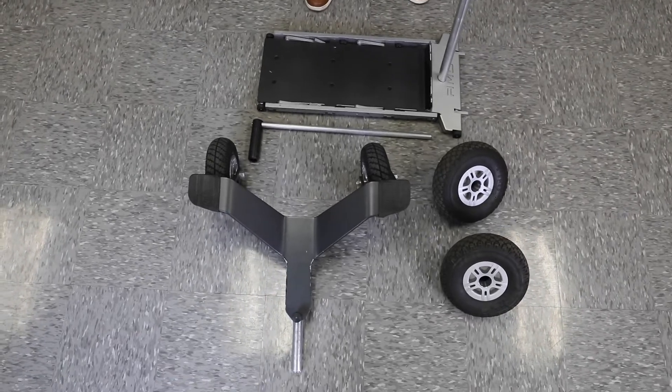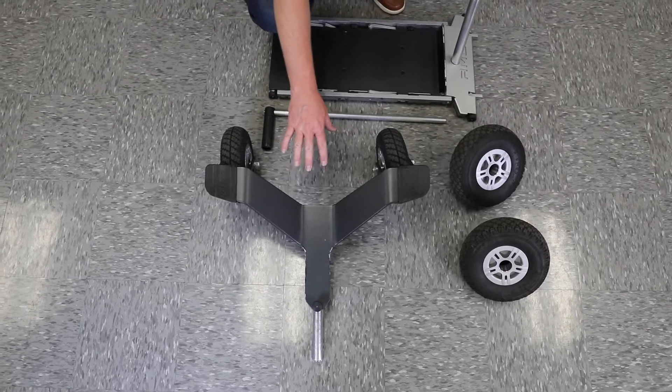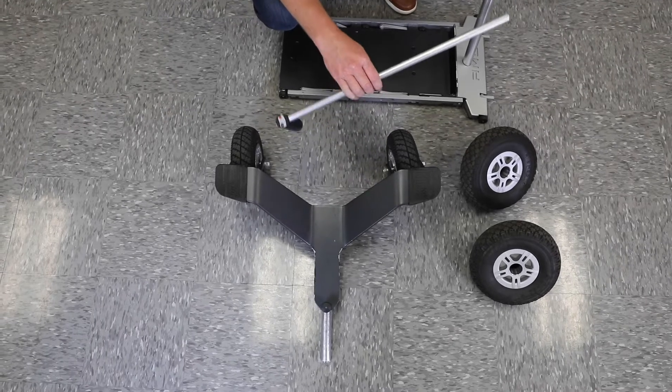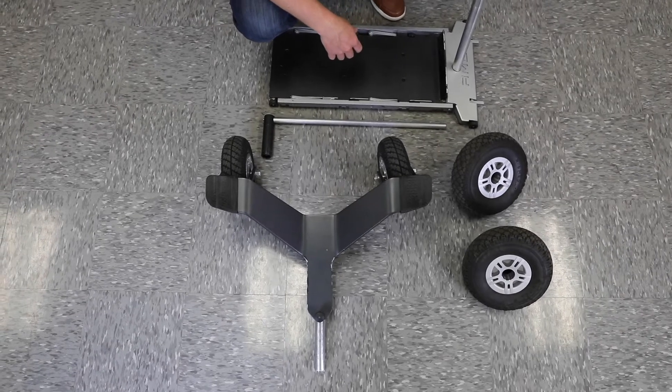All you'll need to switch from the indoor to outdoor or vice versa is the front wheels, the rear tail with wheels, the lift, and the tire wrench right here. We're going to show you how to change the tire, or change it from the indoor kit to the outdoor kit.